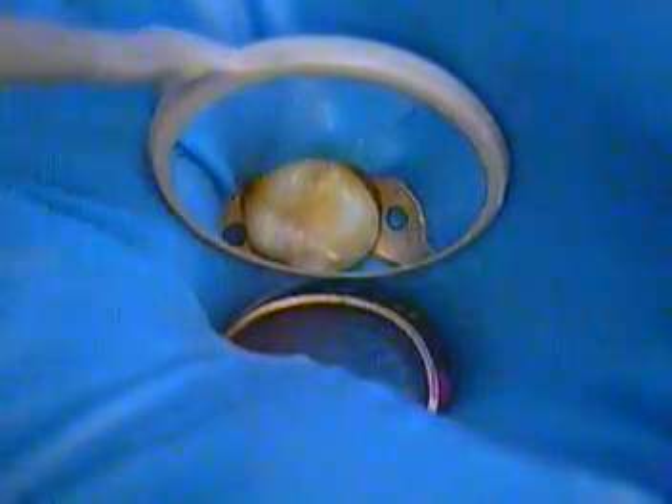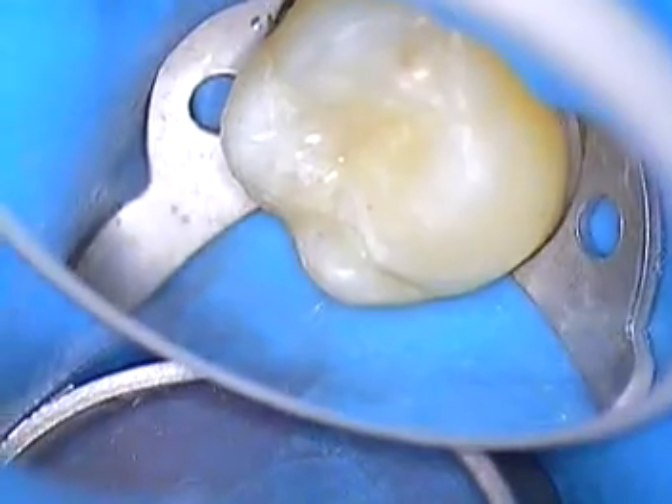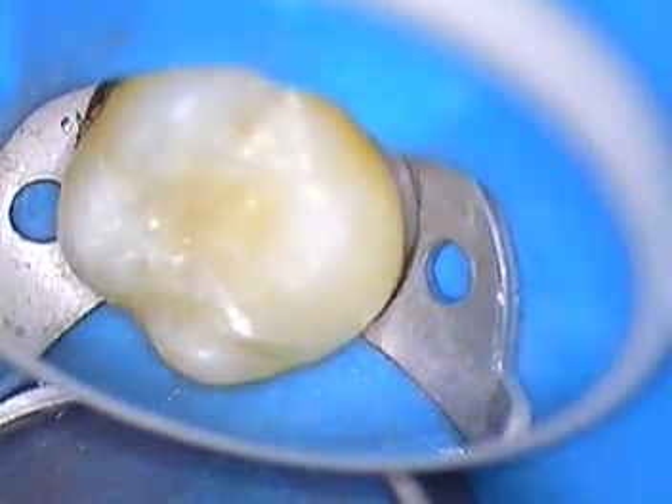We're going to go ahead and cure this and polish. We'll just raise our light now to give you an idea of what that all looks like. Looks great — we like it, and I hope you did too. Take care.